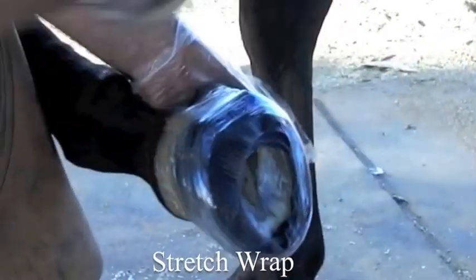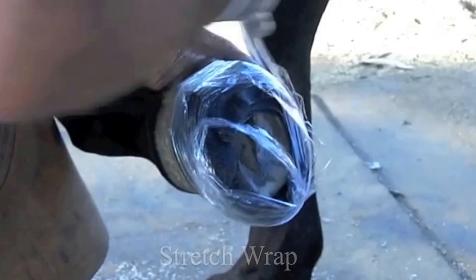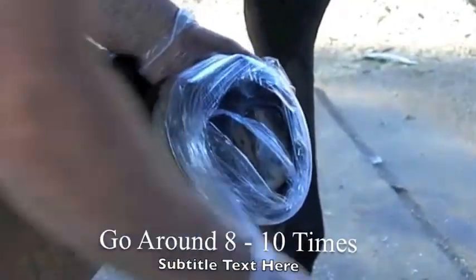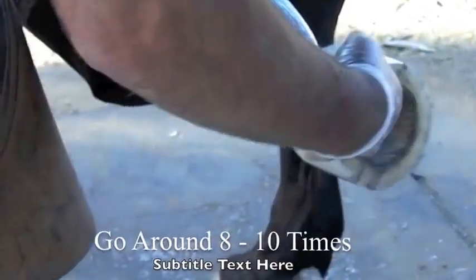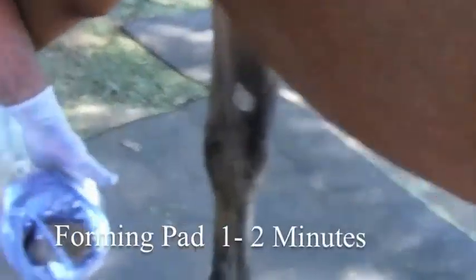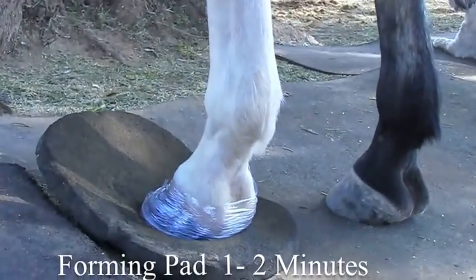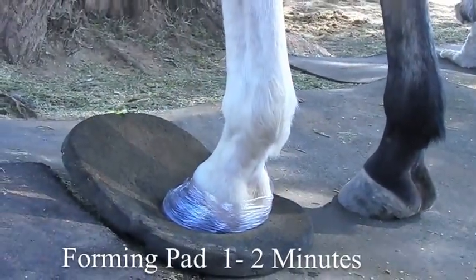For the shrink wrap process, just go around it with some stretch wrap. This is basically to hold the resin and moisture in the cast for better curing, and also so it doesn't stick to the forming pad. Hold it on there for about a minute to a minute and a half, depending upon the weather.